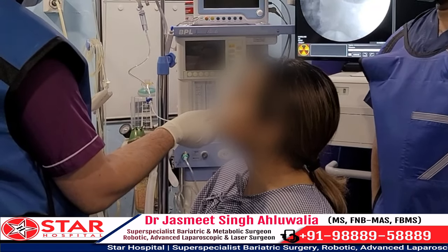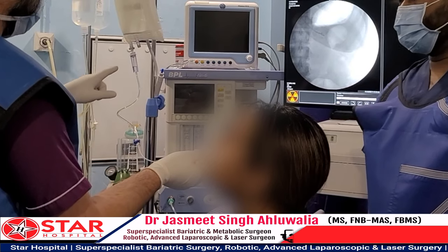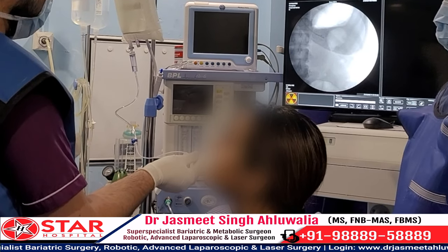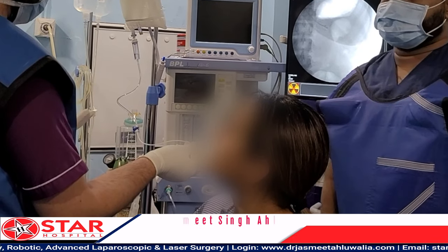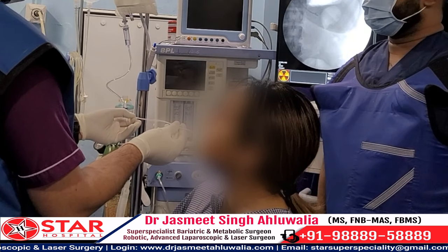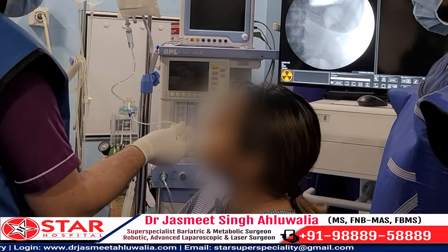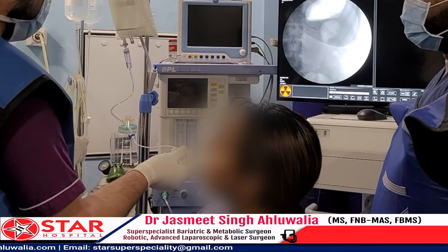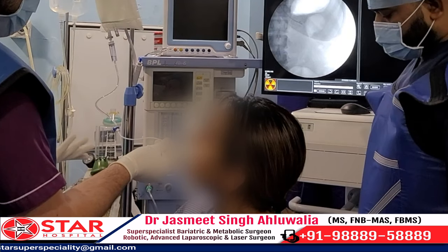This is the only balloon where we can do the entire procedure with the patient fully awake, even without any anesthesia on the throat. Most balloons available in the market require endoscopy, for which sedation is needed for at least a few minutes for both insertion and removal. Whereas the Elurion balloon will deflate by itself after four to five months and will pass out of the body without needing any removal procedure.